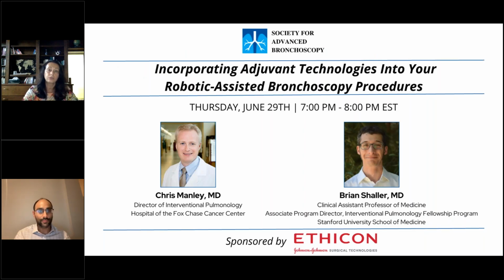If the patient's habitus can cause some kind of a problem, is the patient going to be a difficult intubation? Is the patient so big that the rigidity of the chest wall is so high that maybe our jet ventilation might not be adequate? If the patient doesn't have any pulmonary reserve, what is our backup plan? If the jet ventilation doesn't work, we will have to re-intubate the patient and ventilate them periodically. So I think every concerning point should be discussed on the shore rather than in the middle of the ocean. That's a very good image right there.